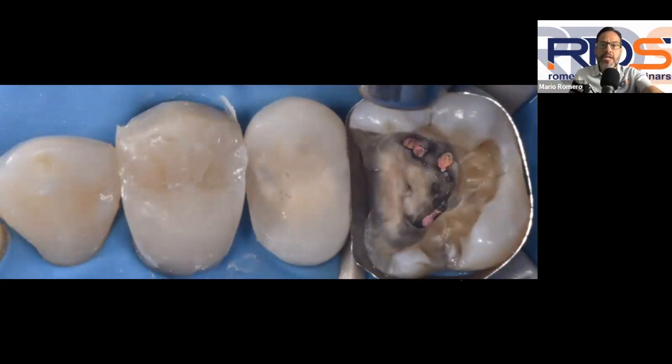Reason number one, normally they are subgingival, which means that when we are preparing or removing either caries or an old restoration in these areas, most likely we are going to damage the gingival tissue around these deep margins. When the bur touches them, or when using different instruments, it aggravates this area, and you're going to get bleeding. Normally, if you have a patient with an active caries lesion at this level, they're going to show up to your clinical practice already with inflammation.